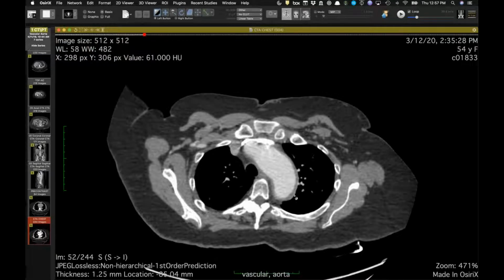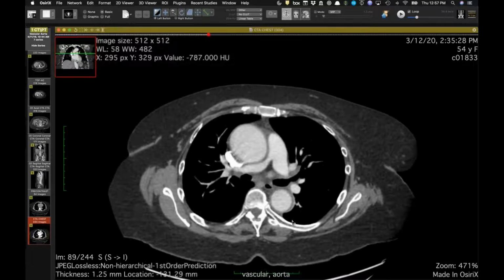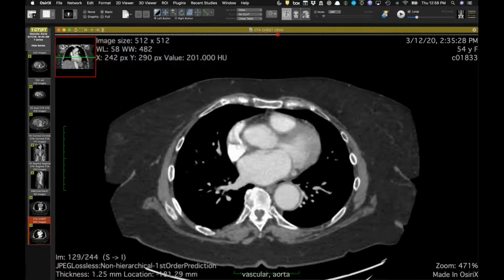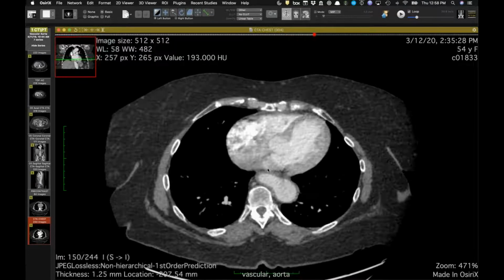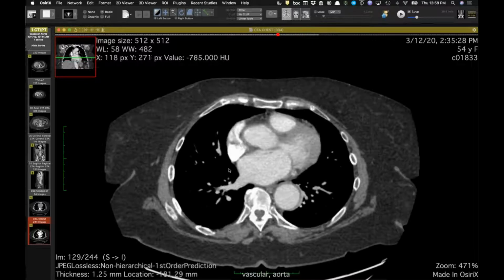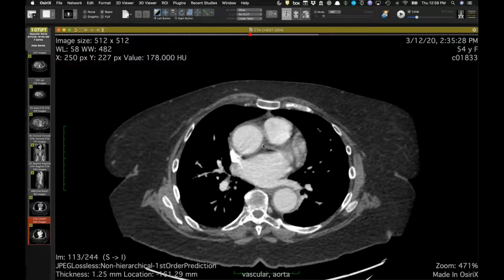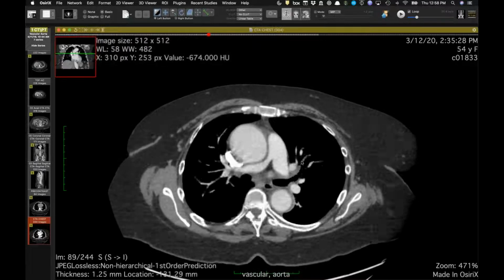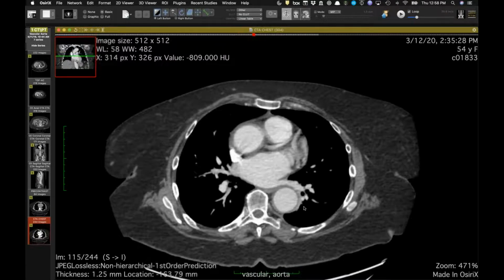This is the more recent CT, and you can see there's a little bit more wall thickening to the aorta. They did do an ascending and hemiarch repair, and there were lymphocytes in the explant of her aorta. But typically, Takayasu, we've shown a few cases of IgG4, but I don't know. This is the first one I've seen a confirmed giant cell.